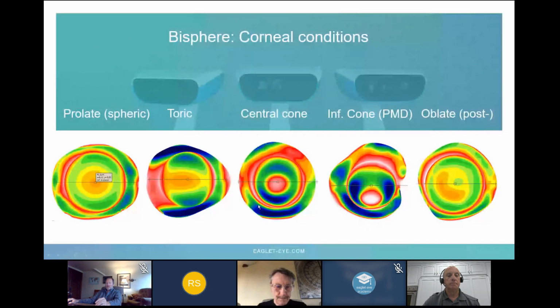And that goes back to the question Ruby had asked earlier. It was a color coding similar to corneo topo. In these maps, the color is telling us. In the scleral profile, the colors are just to highlight stuff. So, you know, that's correct. Those blue are very deep and steep, and those reds are more of those flat areas.